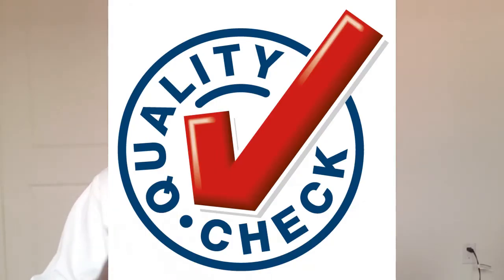The next step is after the completion, the results must be meticulously checked by the MLT to ensure they pass quality control. So once your PCR does the test, that's not the end of the game. The next step that we medical lab technologists take is that we have to do a quality check to make sure that there is no false positive or false negative within your result. And we are giving the accurate, precise results to the doctor that ordered the test. So we put it through a quality check where we check everything, possibly the patient's history, everything, to make sure that whatever results we give are very precise and very accurate.